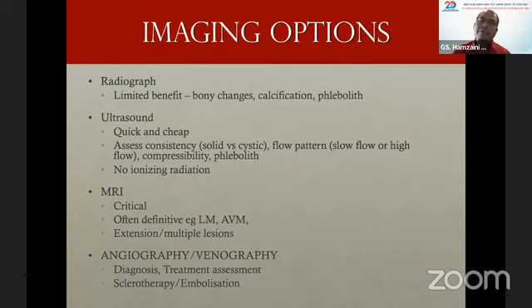Okay, so next is MRI. Our next step of imaging modality is usually MRI, although some patients may have a CT scan, and if the center you are working in does not have MRI, then CT scan will be a great imaging tool. Basically, we look at the cross-sectional imaging of the lesion.